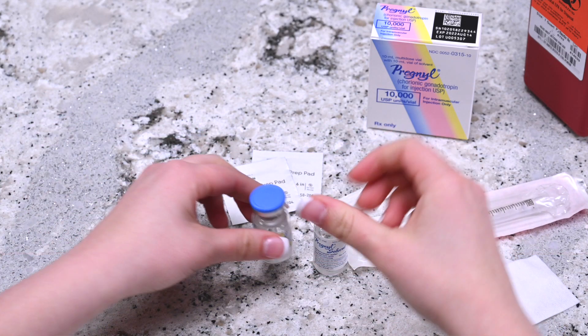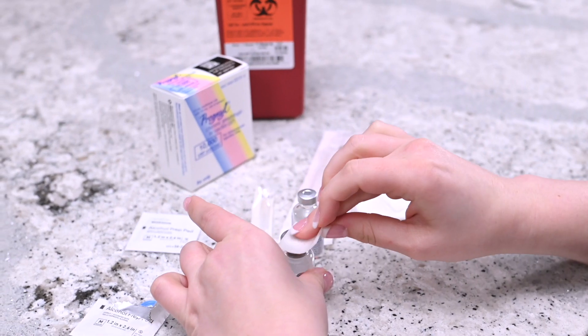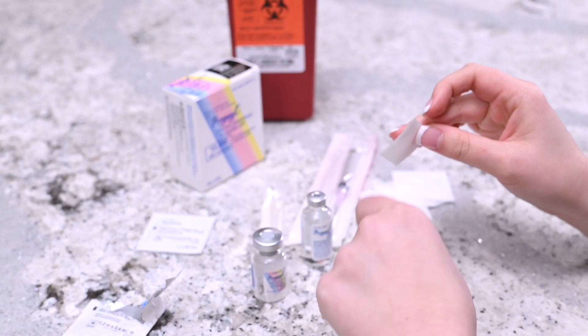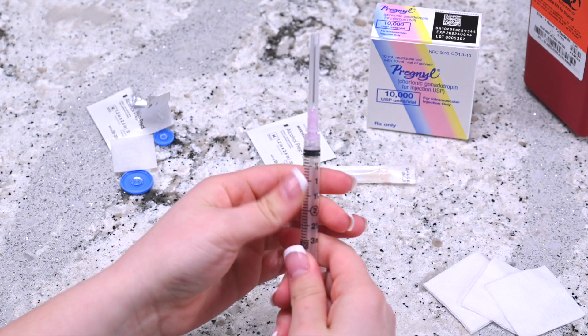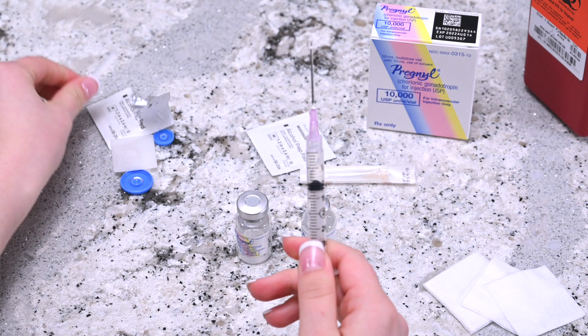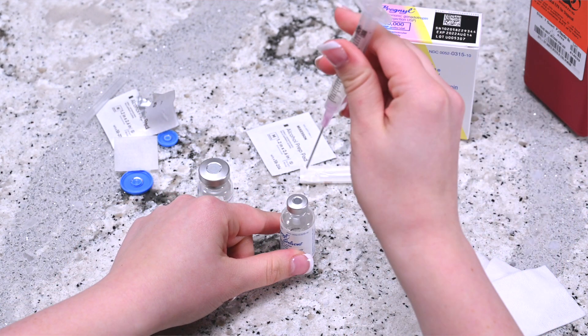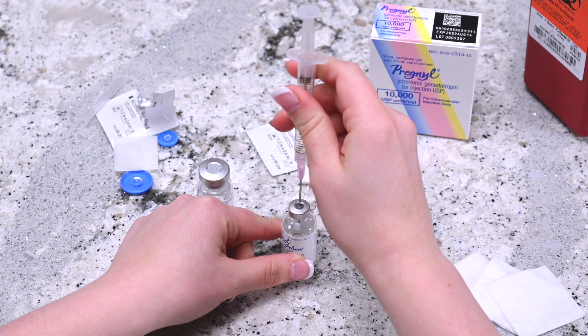Remove the cap from both vials and disinfect the top of the vials with the alcohol pad wipe. Hold the syringe upright and draw in the same amount of air as the dosage required. Insert the needle into the center of the Pregnol solvent vial and push the plunger down until all the air enters the vial.